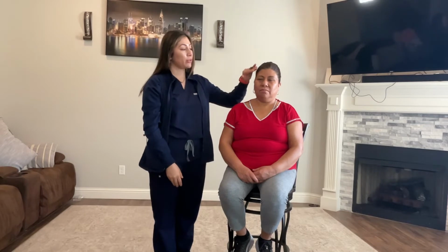Her facial features are symmetrical. Her eyes are in the upper third of the face, the nose is midline, and the mouth is in the lower third of her face. So all of that is normal. I'm going to be looking at your eyes by using my ophthalmoscope. My ophthalmoscope is going to help me assess the size of her eyes, the color, the cup-to-disc ratio, the margins, and any kind of new vessels or hemorrhages or anything found in the eye.